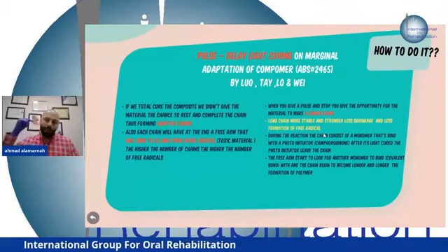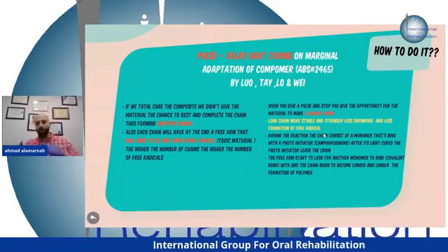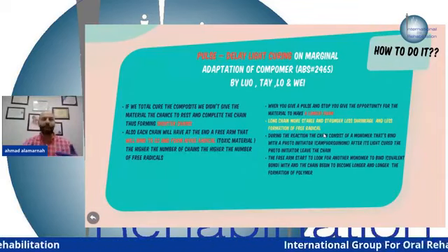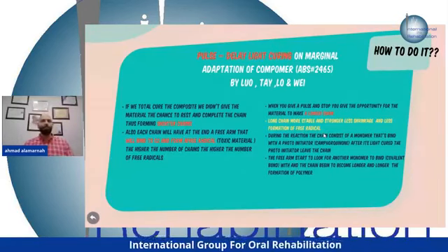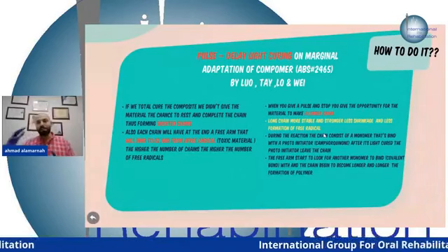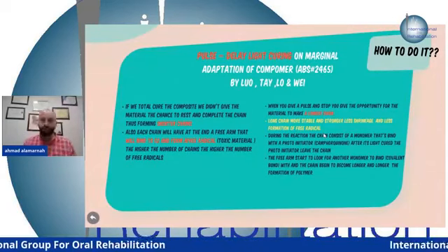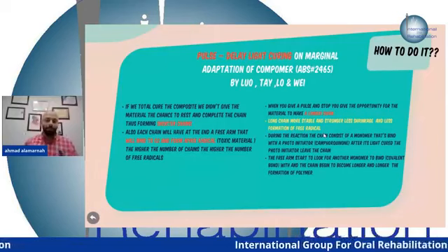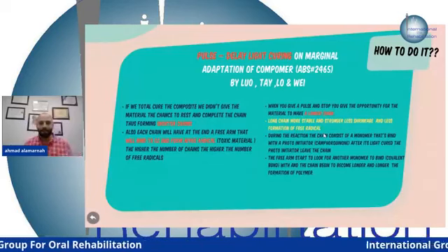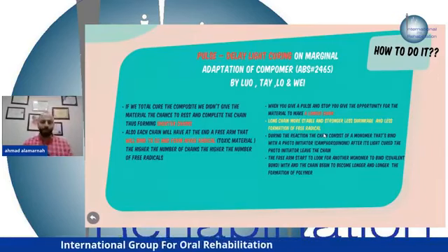You do a single pulse of light for like 1 second. This will initiate the reaction, but the reaction takes its time if you stop. Okay, it will form a longer chain. It will have more particles that bind together, so less free radicals, less free arms. And after you let it rest for 2-3 seconds, you light cure it for 5 seconds. This will stabilize the material, make it a little bit hard. Okay, so you can continue your layering.